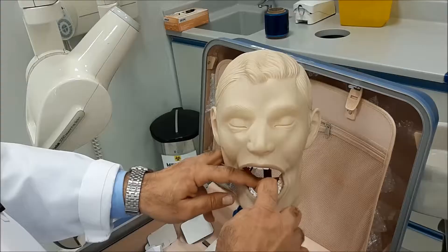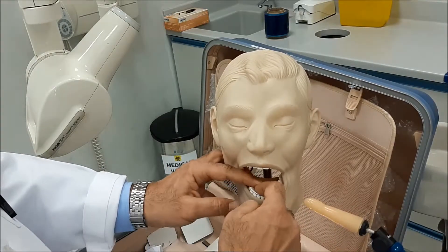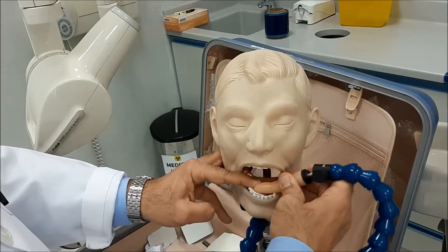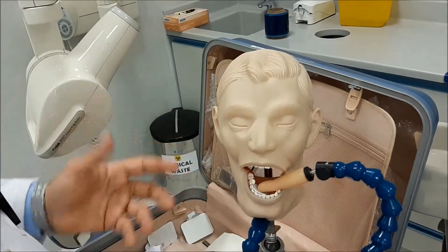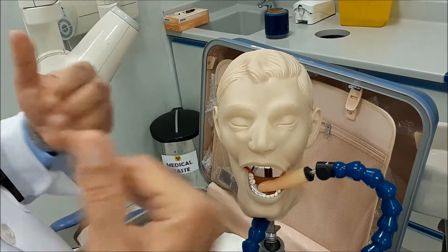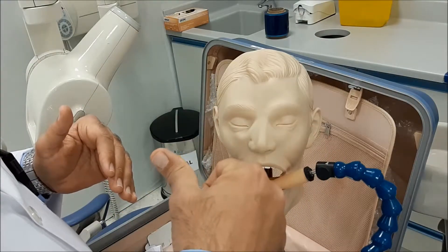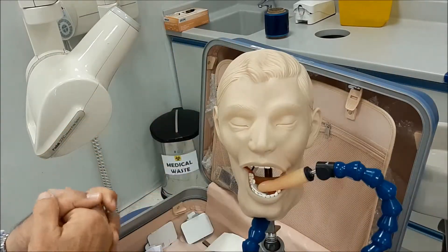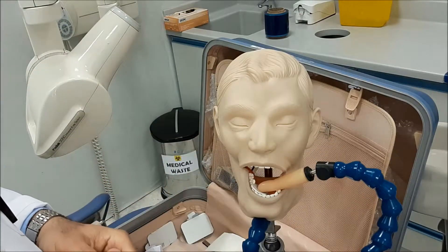After you secure the sensor inside the oral cavity, hold the sensor properly and guide your patient so that the patient will be supporting the film on the crown of that tooth. We don't want the patient pressing down so hard that it causes bending of the sensor, which will affect the image afterwards.